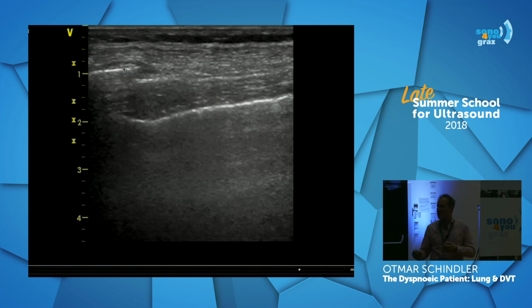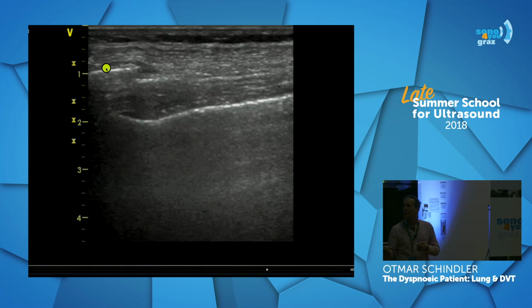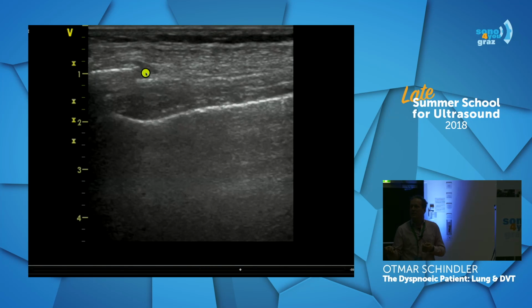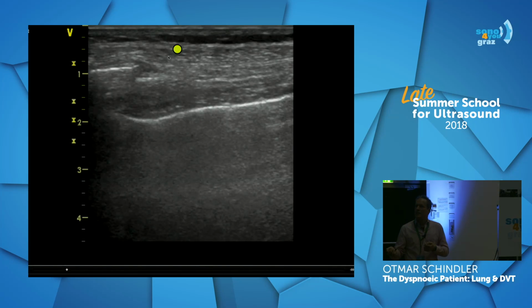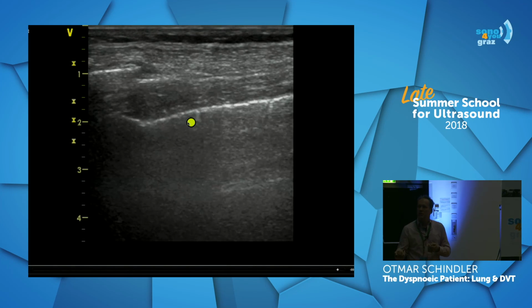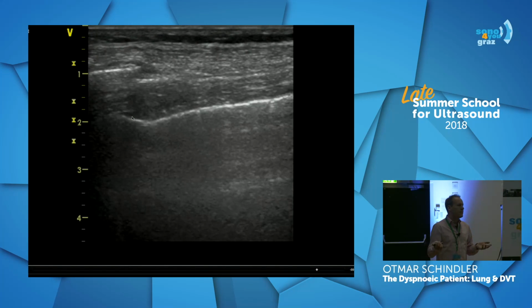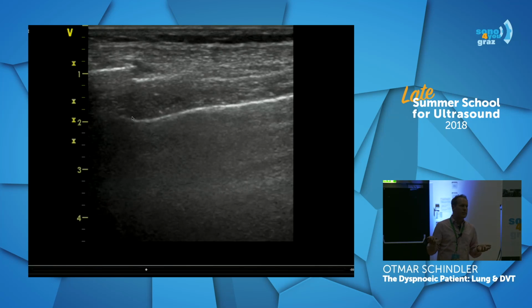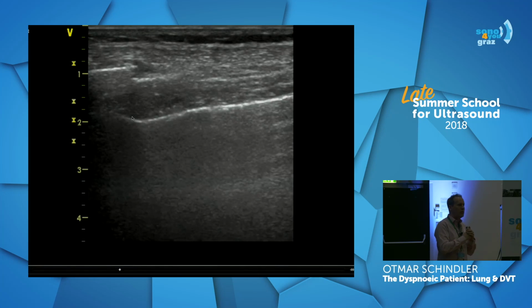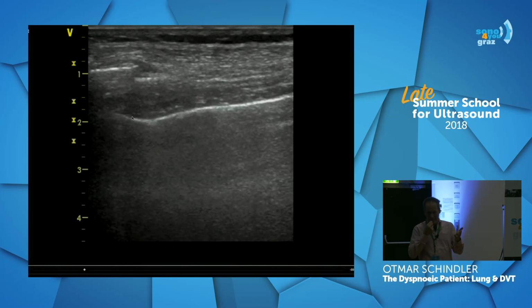So you just put your ultrasound probe there. And you see here the rib, and here there is a little step, and then again the rib. The black thing you see here is the hematoma from the fracture, and down below the rib, you see, what is it? Lung sliding. What does lung sliding exclude? Pneumothorax. And what's our biggest fear in broken ribs? Pneumothorax.